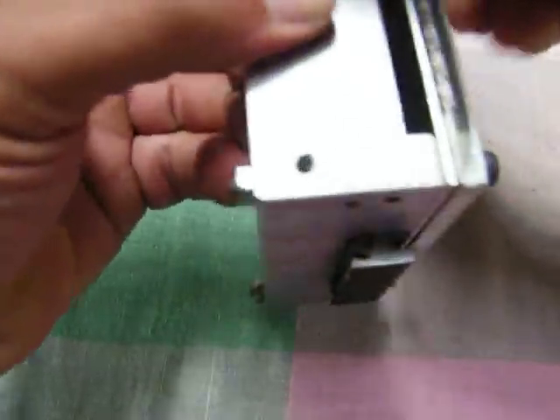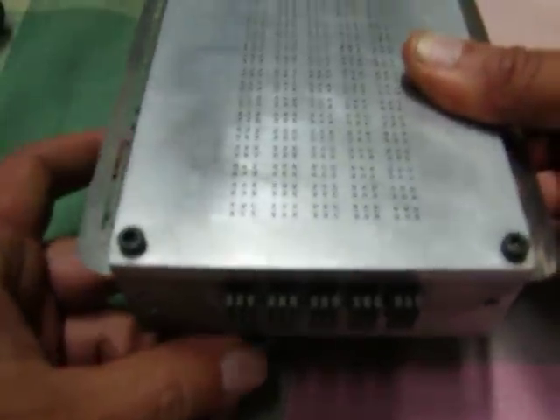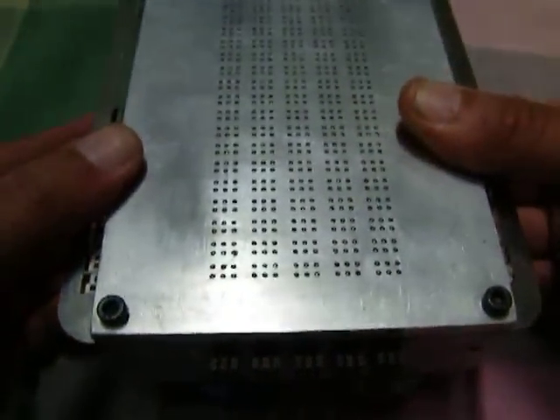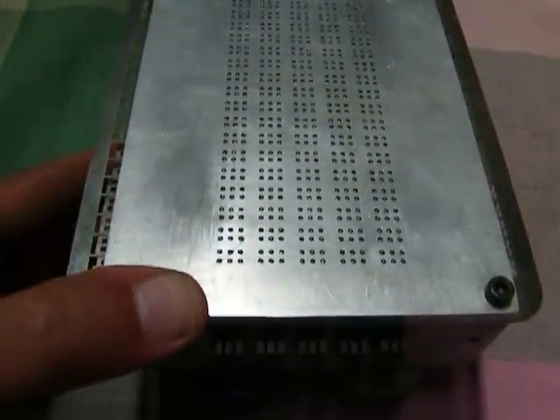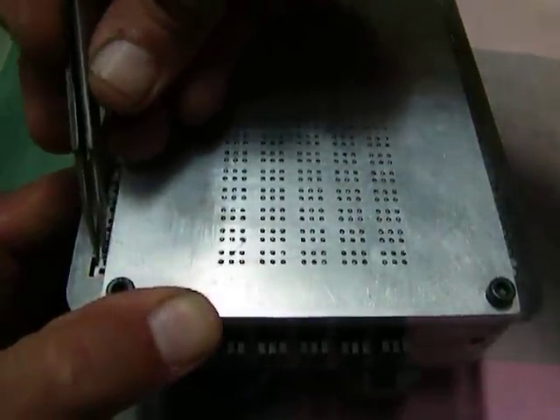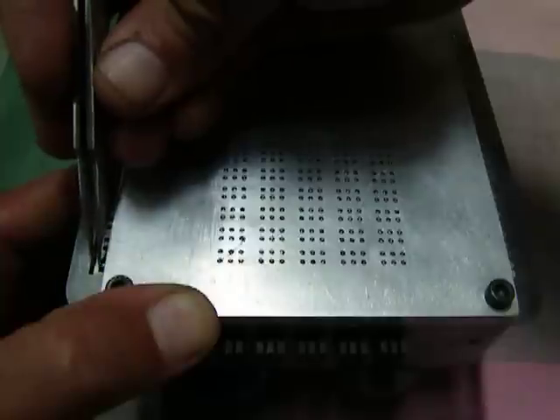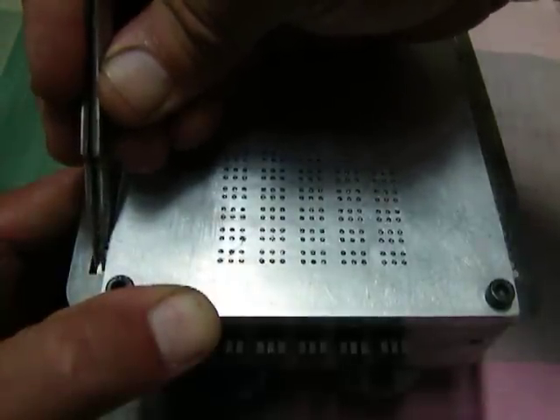But I'm going to go back slowly, turn it around. All the pins are set. Just put these two little supports underneath to position the device so that you can see it. These are the column controllers, the column slides over here that I'm using. Just that little movement, that's open and that's closed. Open, closed.